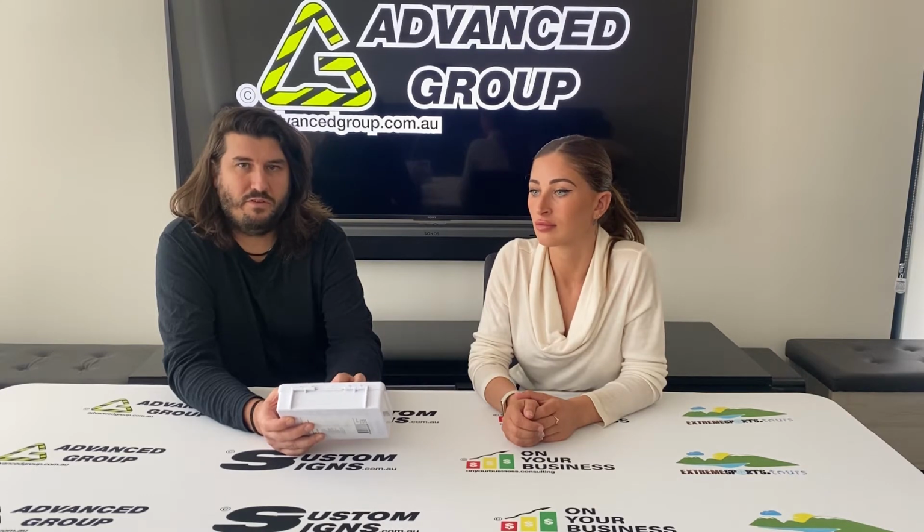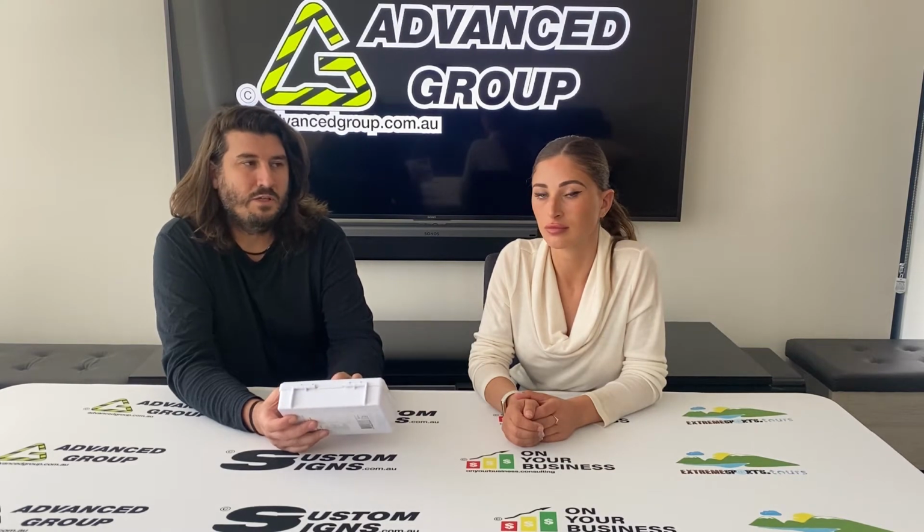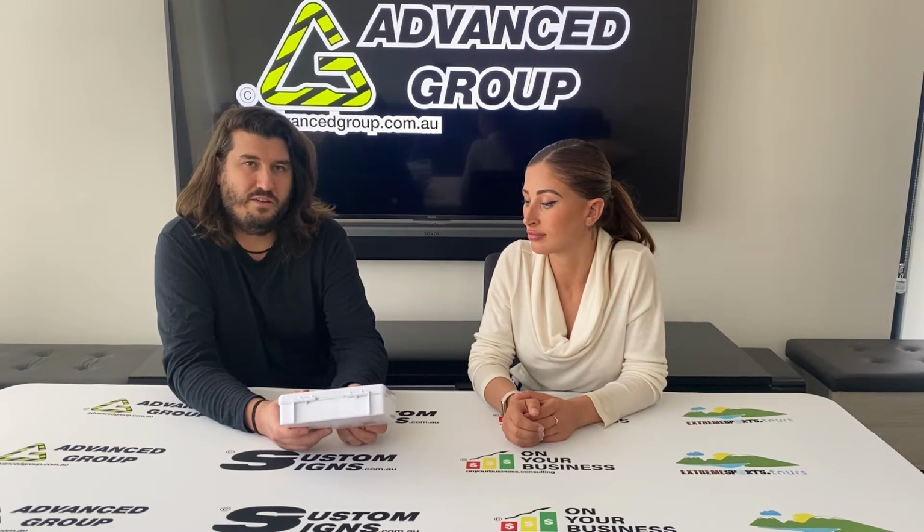When you said there was an expiry date, what in there particularly goes off? You could still use some things, couldn't you? For example, if a bandage is put into this kit that is sterilised, it's been possibly ultra heat treated or something to sterilise any bacteria. But because bacteria can grow at an exponential rate, it might be guaranteed to be sterilised for 2 years, for example. But then that sterilisation guarantee is no longer there, because with air or humidity and moisture in the air, if you're in a humid climate, if the packaging is in some way compromised and some moisture gets in there, the bacteria can potentially spread. You put it onto a wound, and then you could get some sort of serious infection, for example golden staph or something else, which would be unpleasant, unlikely, but there needs to be some sort of a guarantee that the stuff in here is sterilised.